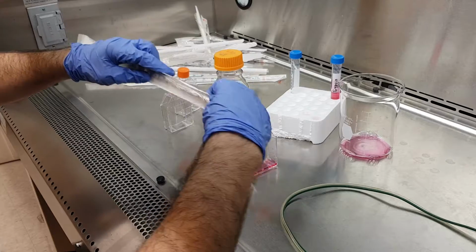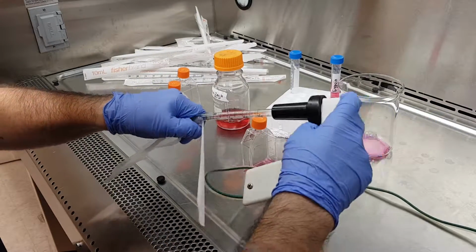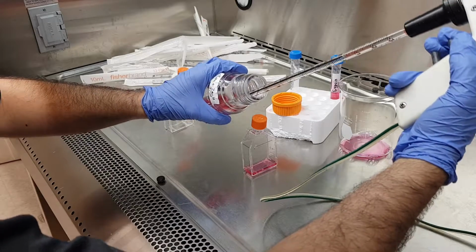Once the cell count has been obtained, use the appropriate amount of flasks to separate the cells from the original flask. Add the appropriate amount of culture media, increasing the original flask volume to 7 milliliters, and separate equally into the additional flasks.